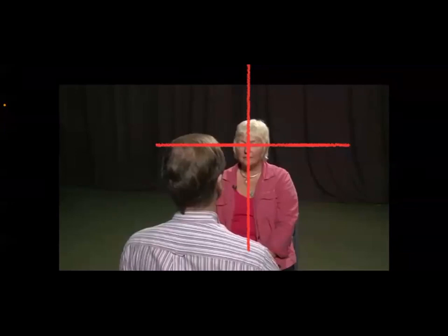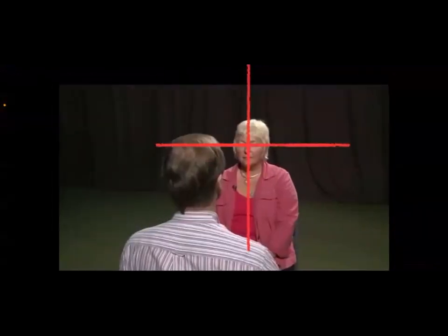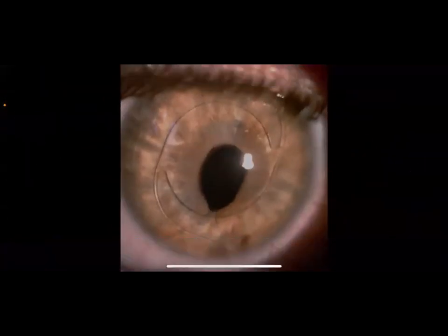the patient's eye, okay. So after examining the visual field, you will move to examine the light reflex. And here in this patient, you'll find that he has got cataract on the left side, and on the right side, the pupil. If you saw the picture, the pupil was asymmetrical. I will share the picture again. Can you see this picture? Yes. The pupil here is irregular because previously he did an operation.